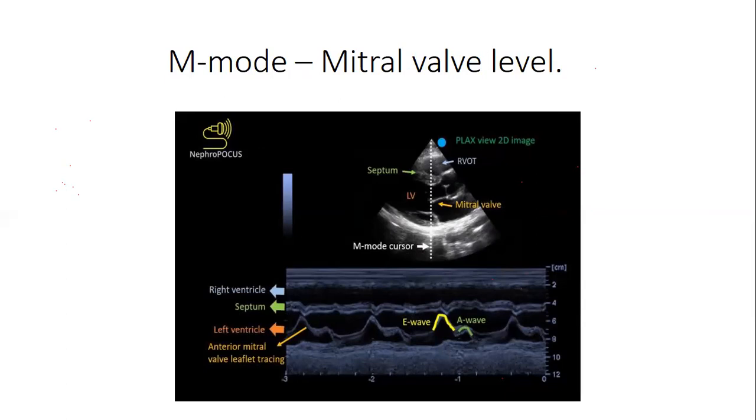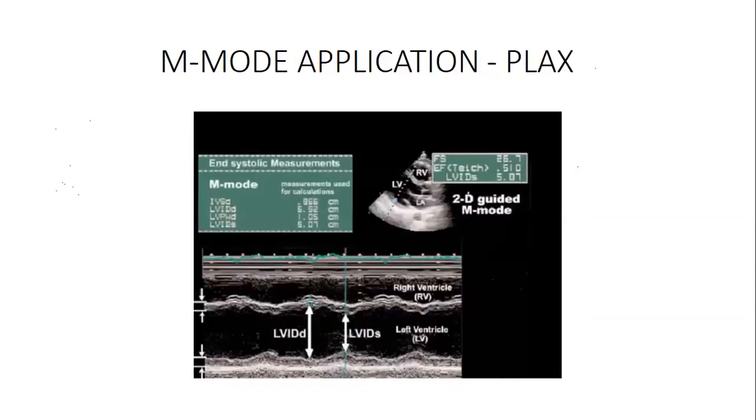I have a question, Mr. Mulenga. Sorry for the interruption. Please go ahead, no problem. So at the LVID, I can go back. Why are we measuring the internal diameter at each level in diastole as well as in systole? Do we have to do this whether we're doing a normal cardiac exam? Is it a routine, or why are we doing it?